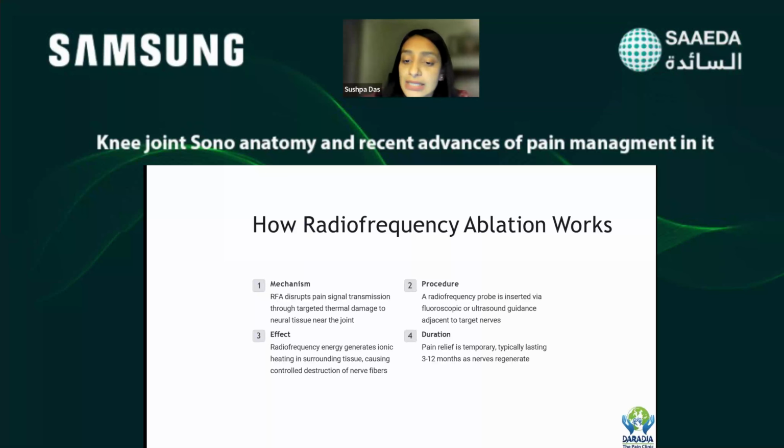And still, if we are looking at the axial spine, it is seen that it is better to use the fluoroscopy as well as ultrasound if we want to increase the accuracy. So for large joints, if you do not have an X-ray machine or a fluoroscopy machine, then it is okay. We can safely go ahead with ultrasound. We are usually very happy with the results. In case of spine, in our institute, what we try to do is combine fluoroscopy along with ultrasound.